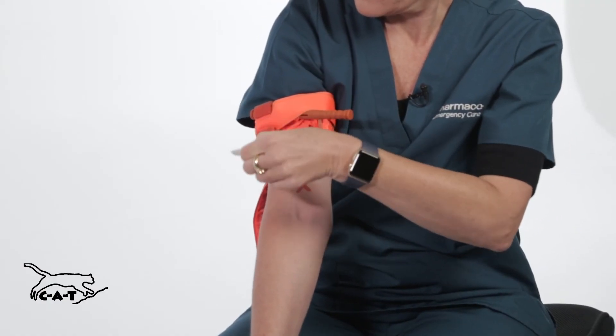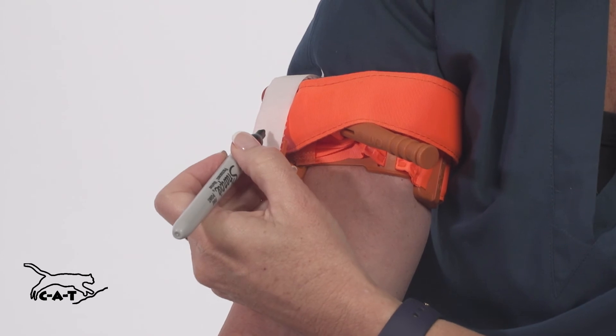Secure the time strap and write the time of application on the time strap.